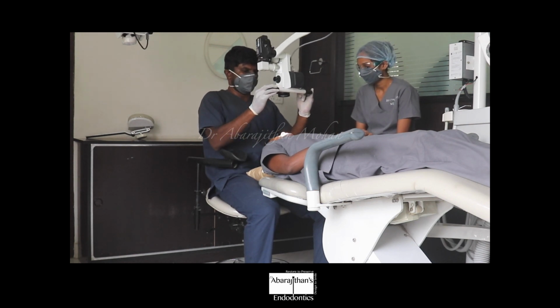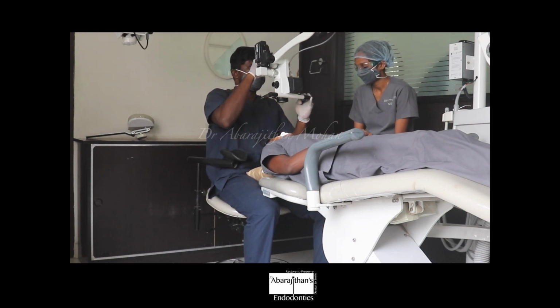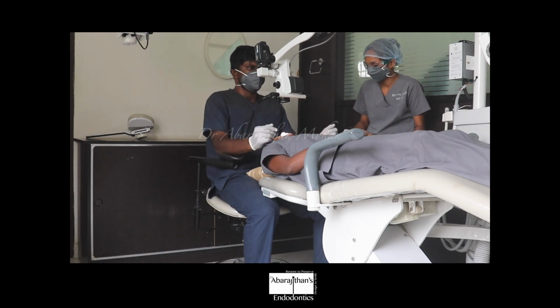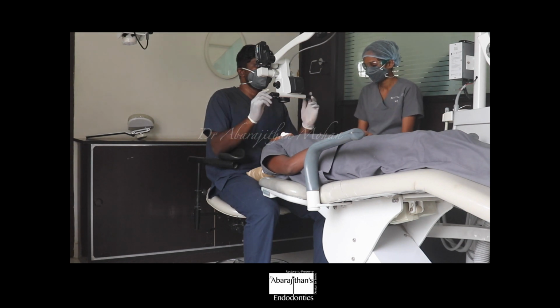So you can see here the operator is making sure the armrest is in position and the microscope is in its very convenient position. So this is how we go about. First the operator adjusts his stool for comfort. Then the microscope is positioned according to the operator's sitting, and finally the patient's chair has to be adjusted up and down to do the focusing.